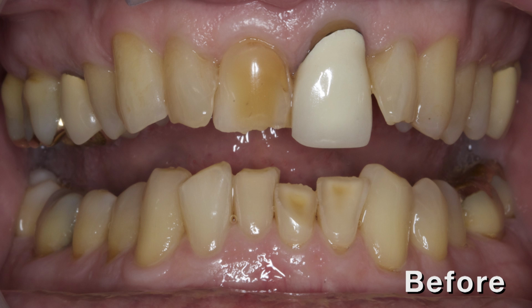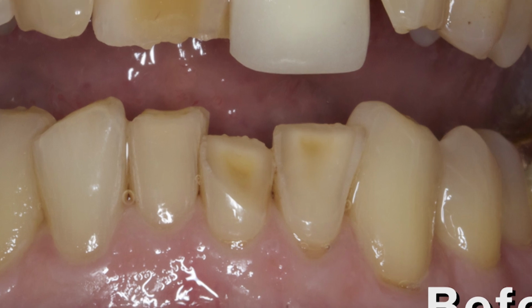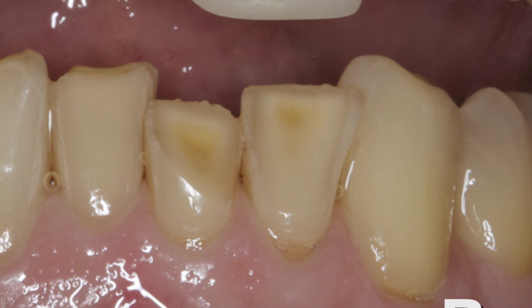While the restoration lasted quite some time, upon further inspection you can see one of the unfavorable characteristics of feldspathic porcelain in how it abraded the labial and incisal surfaces of the opposing central and lateral, and this is due to the inherent surface roughness on the porcelain.